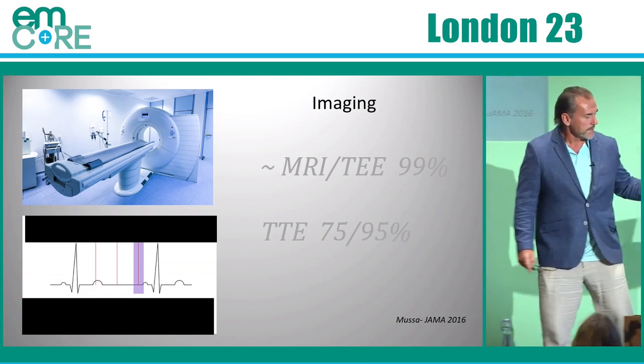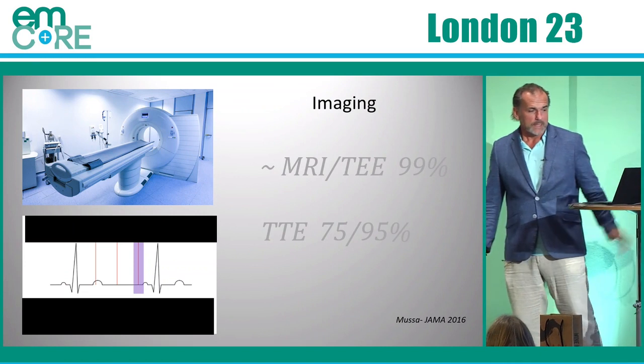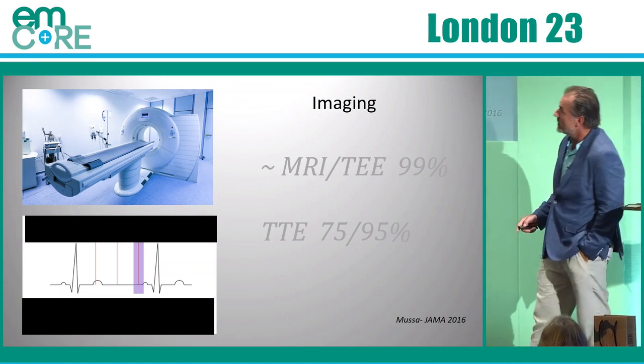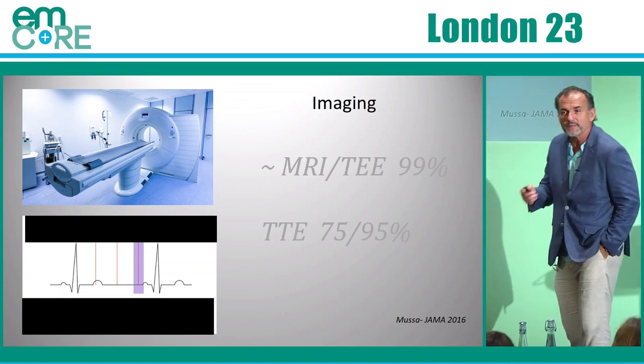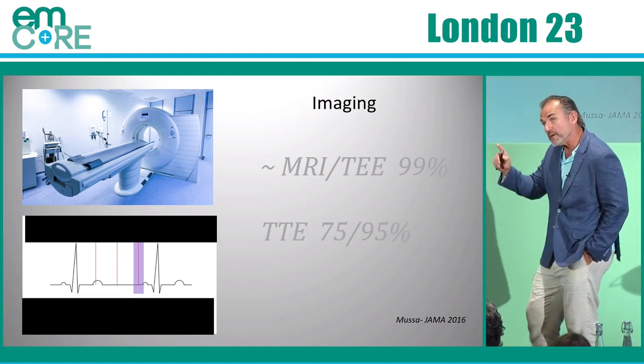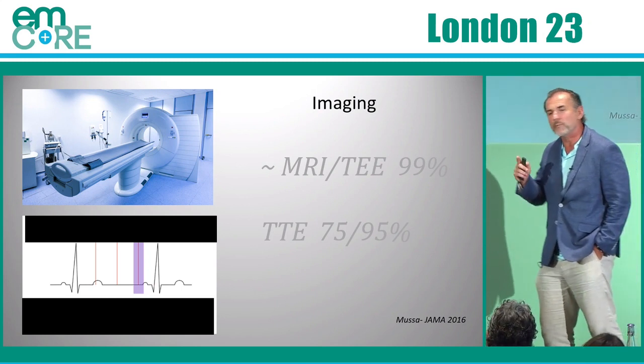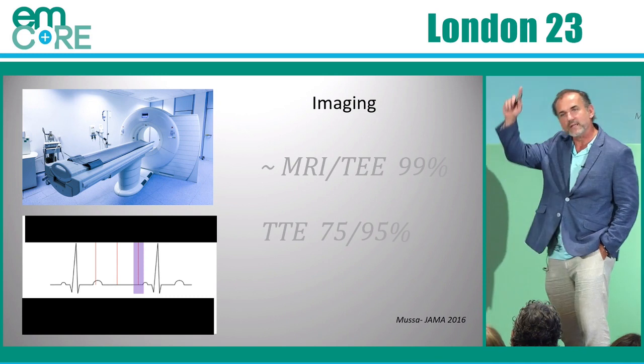So what do we do then? Well, imaging is where we have to go, right? So we start with the CT. Everybody gets a CT angio. Now, you don't angio just part of the aorta, right? The aorta is big. So whenever we order for acute aortic syndrome, yeah, but Joe, I'm only worried about thoracic. No. They're getting the whole aorta.